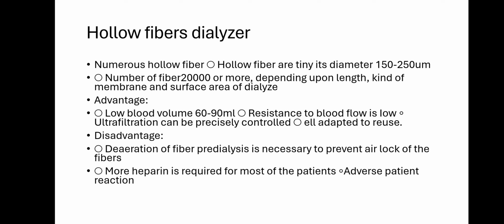Then the advantages of the hollow fiber dialyzer: it has a low blood volume of 60 to 90 ml, and the resistance to blood flow is low. The ultrafiltration can be precisely controlled. It is well adapted to reuse.